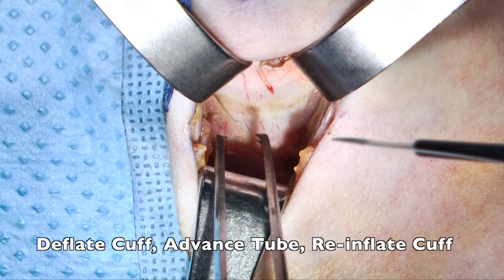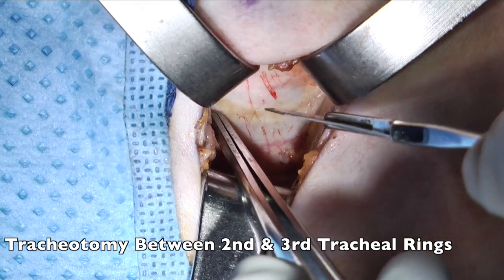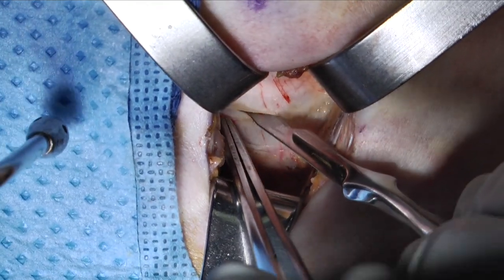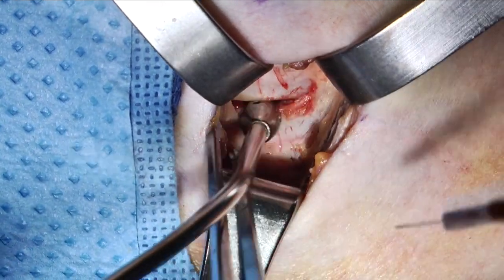Either the anesthesia provider or yourself may deflate the cuff, advance the tube, and then reinflate the cuff in an attempt to prevent inadvertent puncture of the endotracheal tube cuff. The tracheotomy is made between the tracheal rings and extended to an appropriate distance. Blood is suctioned away to allow for appropriate visualization of the airway.